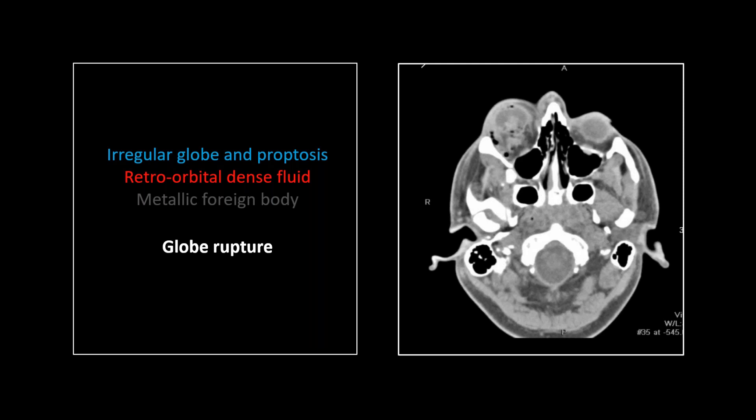So if you see anything out of round — as old Dr. Pitt used to call it — anything that is not perfectly round, you should be considering calling it. That's especially true with the globe and the femoral head. Here you can see it's obviously distorted. There's increased density inside consistent with hemorrhage, and there's quite a bit of retrobulbar stranding and gas as well.